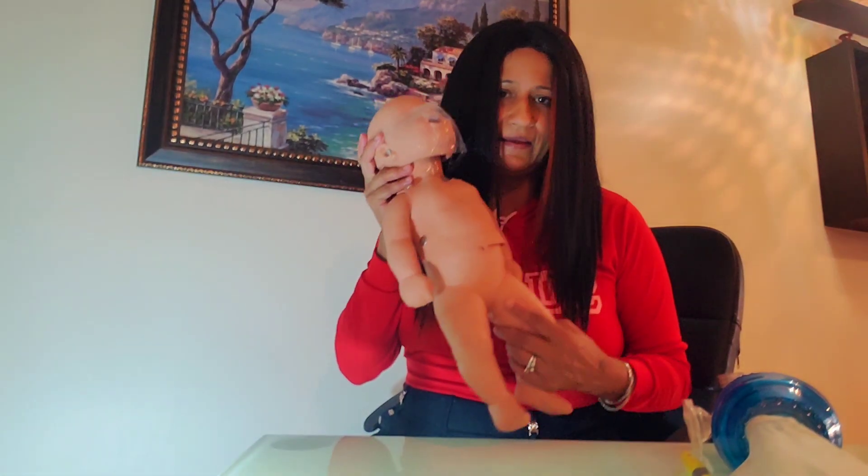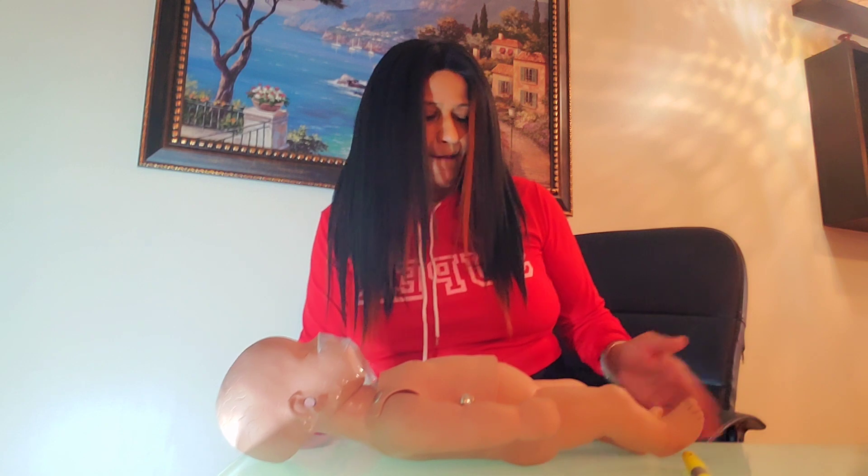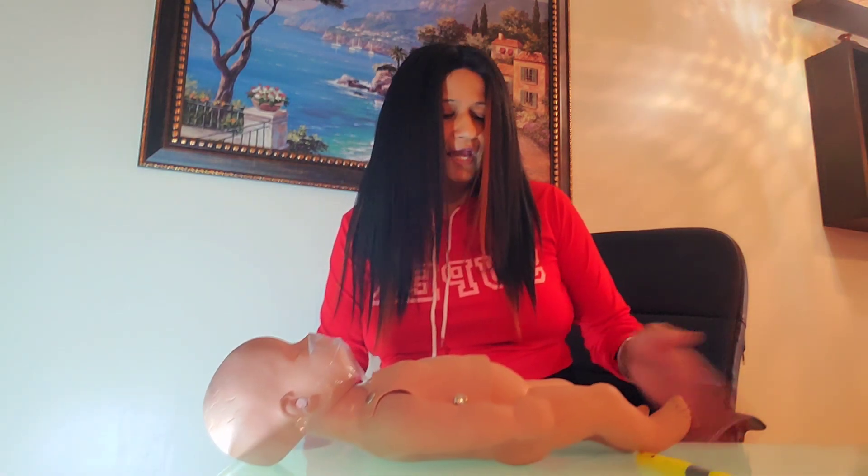I have my mannequin here. The first thing you want to do is tap under the feet: 'Baby, baby, are you okay? Are you okay?' He's not responding or breathing. The next step is to shout for help: 'Help! Call 9-1-1 and grab an AED.'